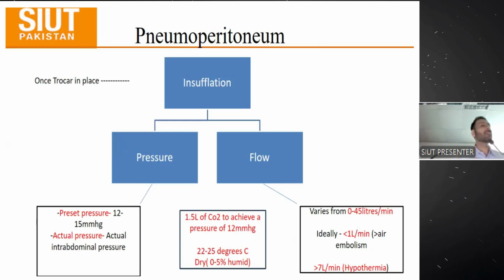And the carbon dioxide that is delivered to us is usually at room temperature, 22 to 25 degrees Celsius, and it is dry with a maximum of 5% humidity.